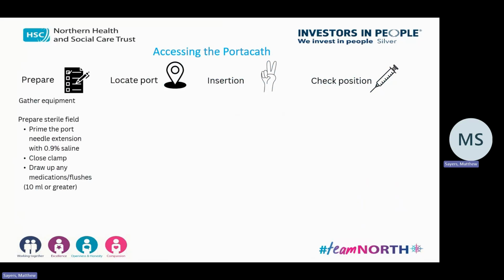The key thing, just to remind you again, is to have that port primed. So Lisa has opened up, she's sterile, she's opened her Huber needle, and she is flushing the line so that there is no air, and then she's clamping that off.